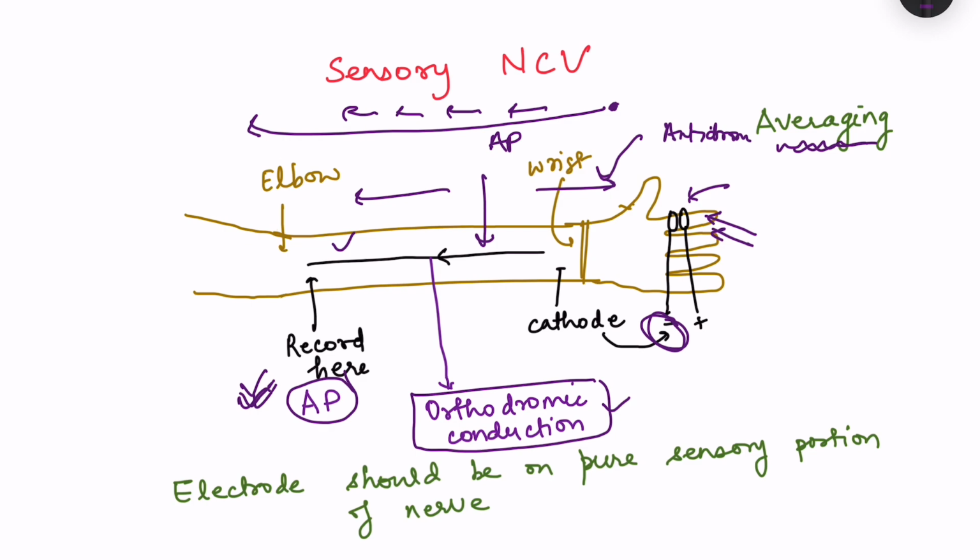The noise which is there, that means unwanted signals which are being recorded, will cut off, because noise doesn't have a pattern. It will all cut off. Okay, when we sum up the noise, it will become zero. While the action potential has a particular pattern, so it keeps on adding up, right? So in comparison, the noise is cutting off, and the action potential is becoming stronger with each stimulus. Stronger means we are just adding up the voltages. Okay, so that is visible. So this is known as averaging.